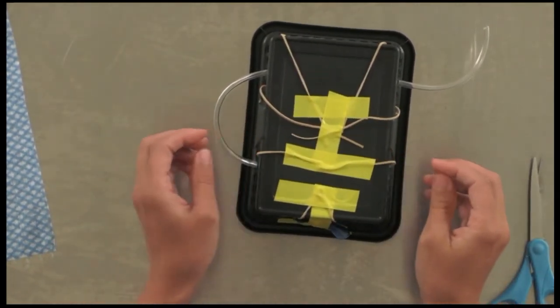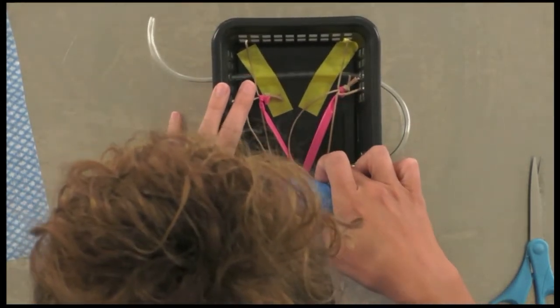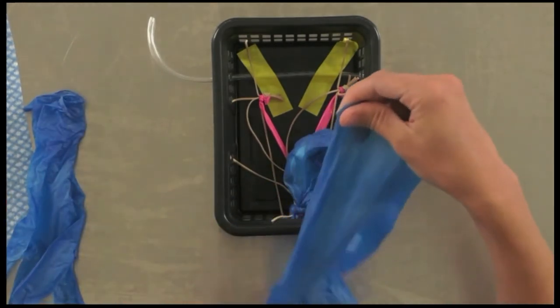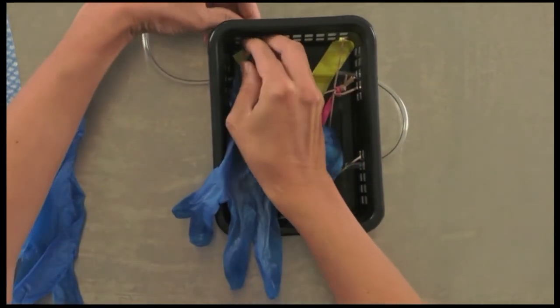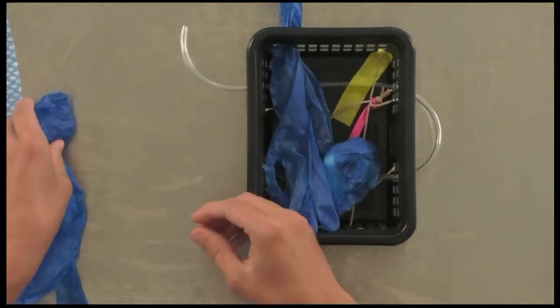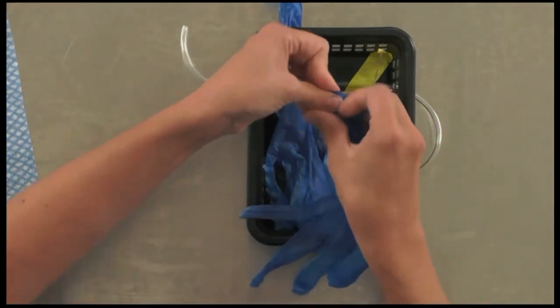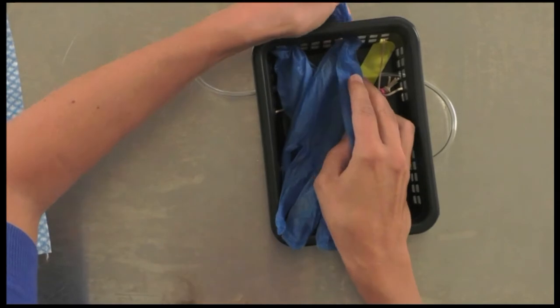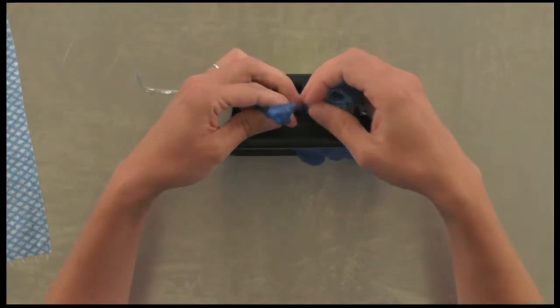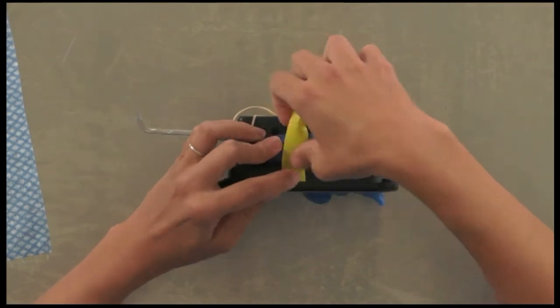That's the setup for all the organs. Now add your omentum using some gloves — put the wrist end toward the cranial aspect and the finger end more caudally. Squeeze them through one of the holes in the basket and lay them over your organs so they get in your way, because that's what the omentum will do. Secure with tape.